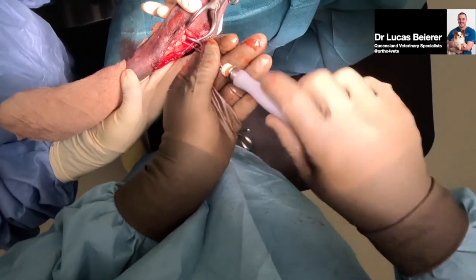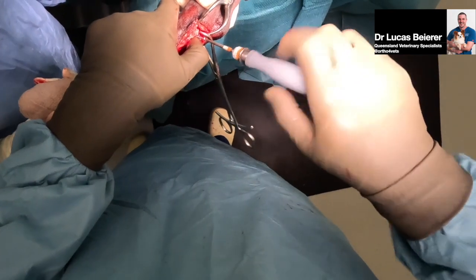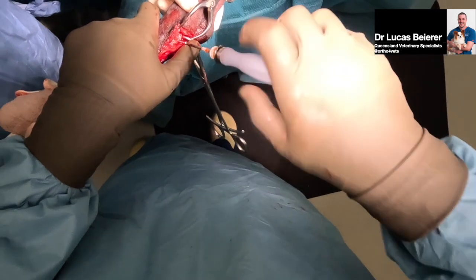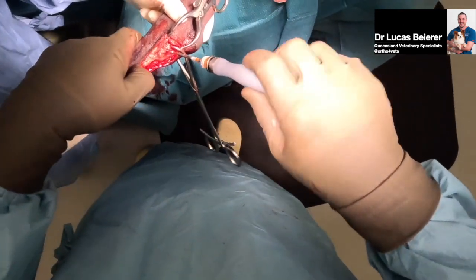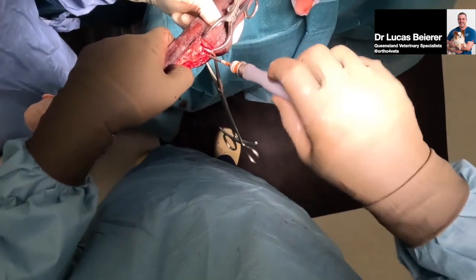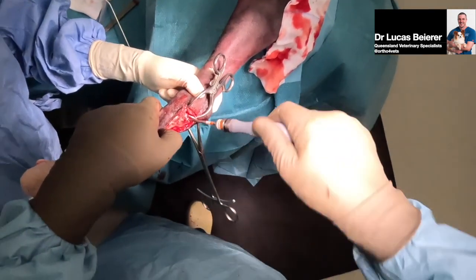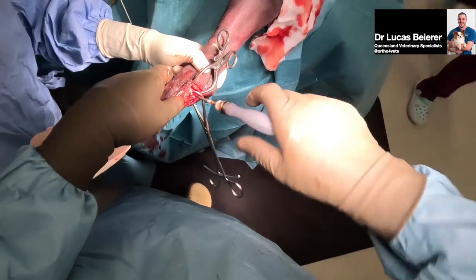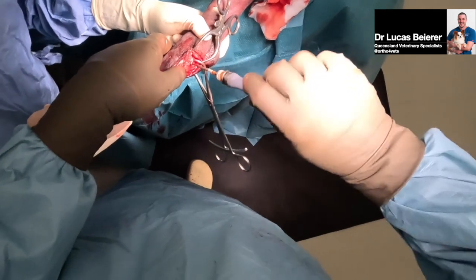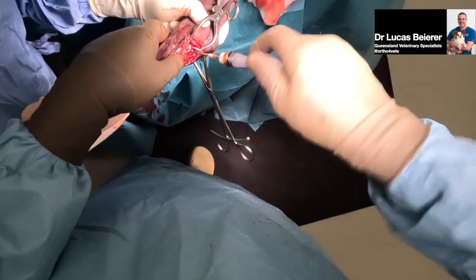I fear that I've gone a little bit too distal and across the joint space here, but again, I don't think that's a big consequence. It'll still be in firm bone. So what we'll do next is we'll take off the proximal part of that fifth metatarsal to create a flat surface with the oscillating saw, and then we'll contour our plate. Do you want to see if that plate press is ready? Feel that coming through already, so it might be a tad long, but I think we'll be okay.